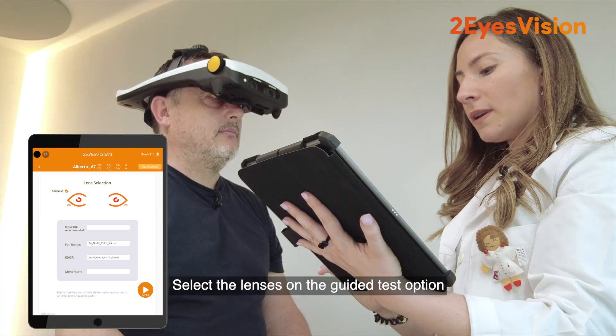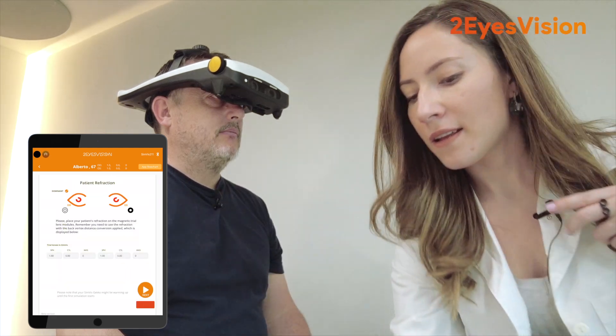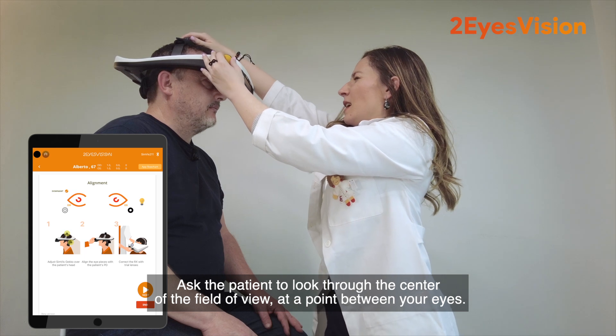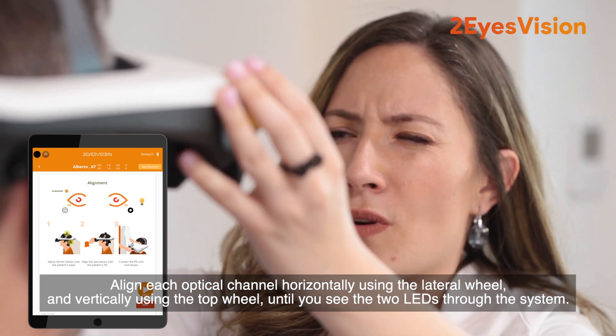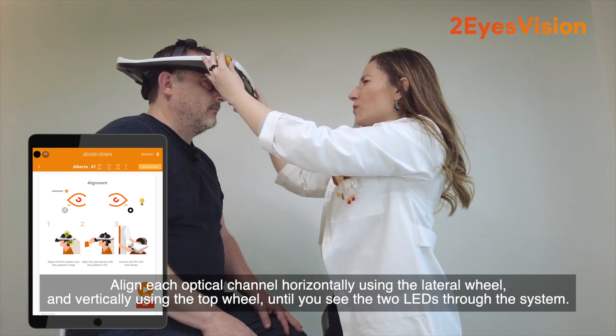Select the lenses on the guided test option. Ask the patient to look through the center of the field of view at a point between your eyes. Align each optical channel horizontally using the lateral wheel and vertically using the top wheel until you see the two LEDs through the system.